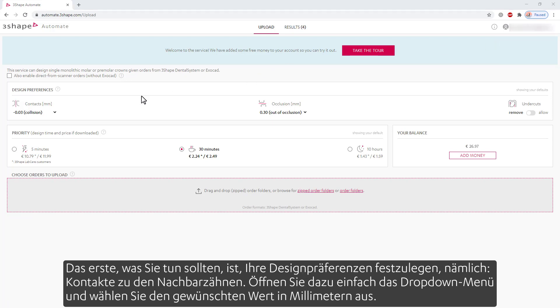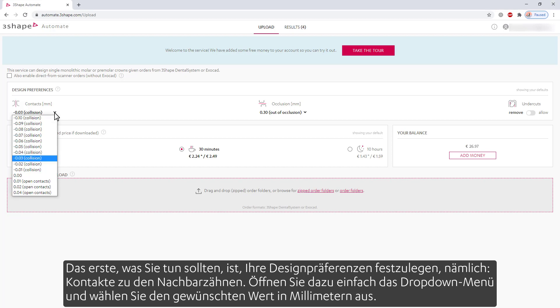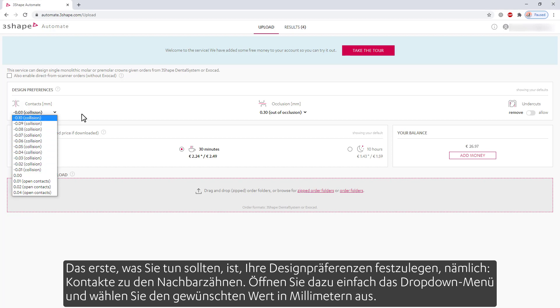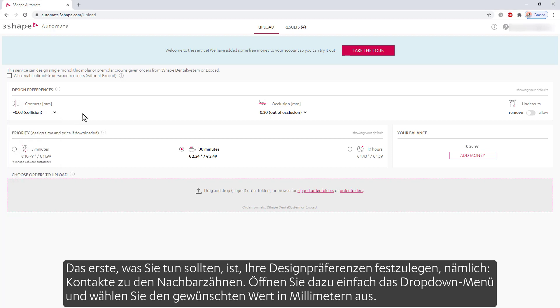The first thing that you should do is set your design preferences, which are contacts to the neighboring teeth. To do so, simply open the drop-down menu and choose the desired value set in millimeters.